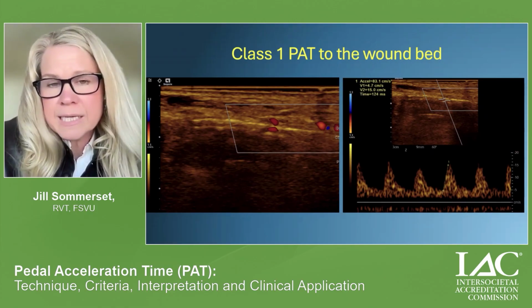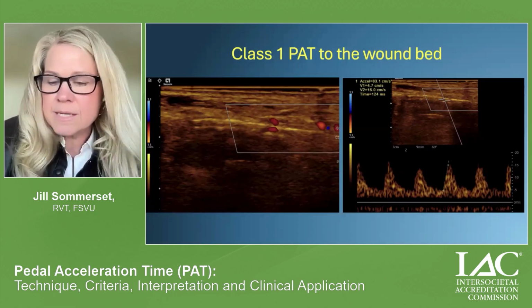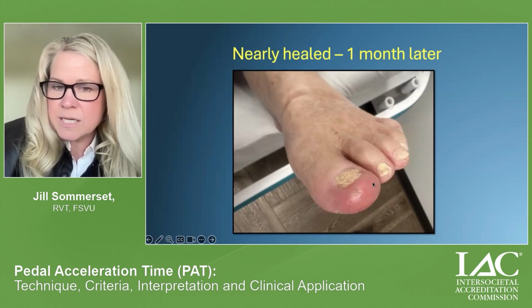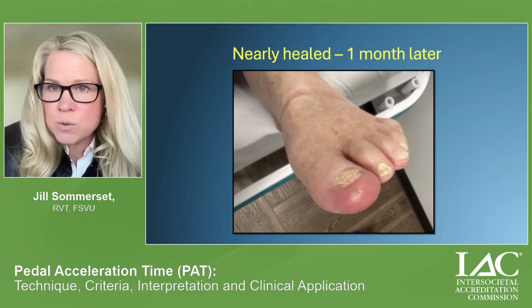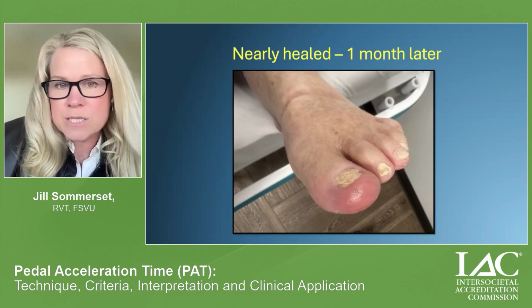And if you recall, to heal a wound, we need a PAT of less than 180 milliseconds. So no intervention needed here. We saw him 1 month later. His wound is nearly healed. It's just a little red. He's on some antibiotics, but he's doing really well. So you can see the value in using pedal duplex in these complex patients.